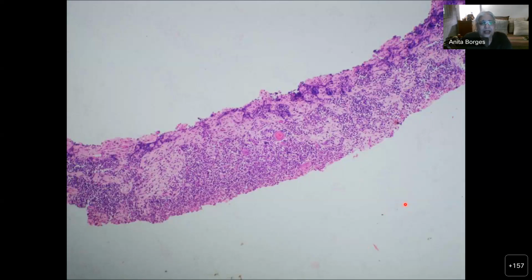Okay, and immediately, even at this far, you can see something. What is it, the something that you can see? Come on, guys, you can see it. What is seen? Somebody see it. You want me to point it out? Here. Hassall's corpuscle. Excellent. Dr. Bhakti says Hassall's corpuscle.